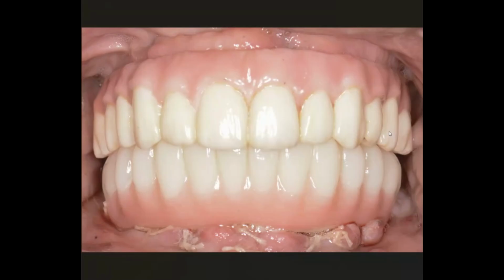But I want to share now the results of that procedure. First set of teeth. Okay, mind you, the beauty of this study is that it's controlled to the mandible. I picked this case on purpose because the maxilla was fixed and the patient was 14 plus years happy with the results. No cosmetic changes. The maxilla, we're not undertaking that task. We're just doing the mandible only. So it's a good controlled study.